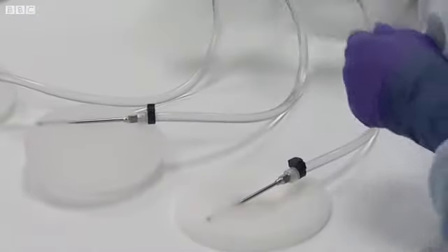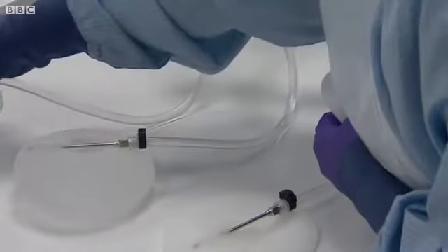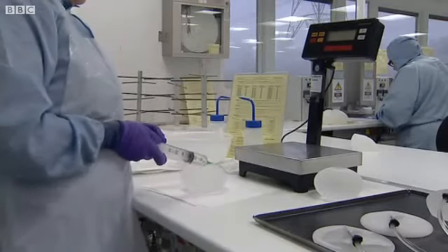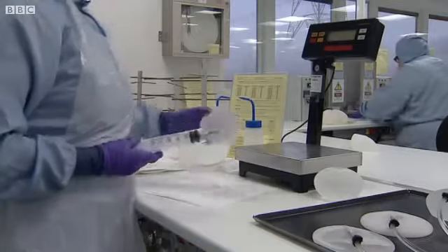During that stage, we also create a small channel which enables us to conduct the gel filling operation. And the gel filling operation is conducted at this stage here, whereby it's a pressurised vessel through a manifold, open a set of valves and fill the gel to required weight. At each stage it's checked for weight and checked as we go through the process.